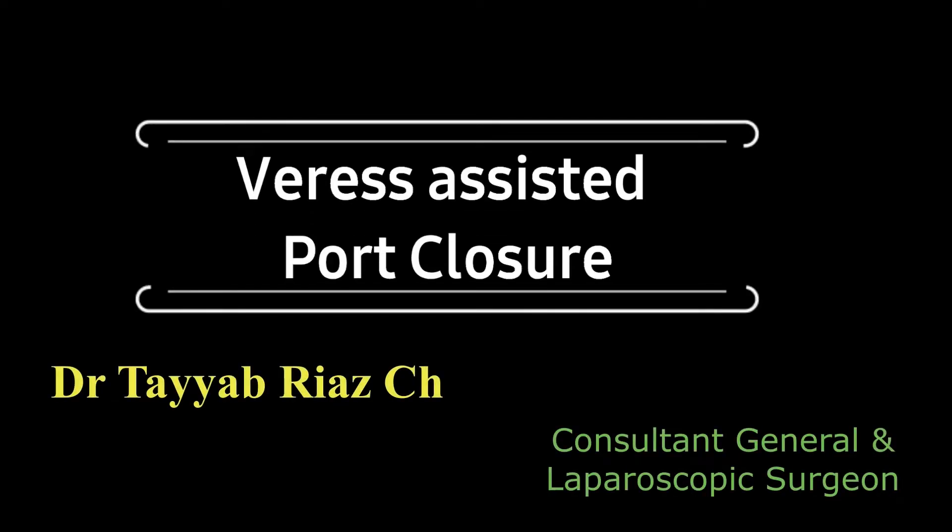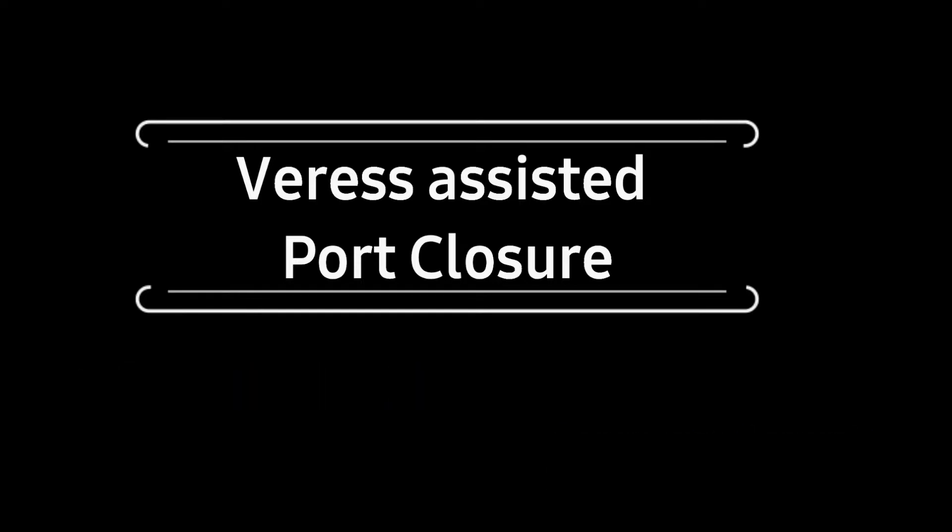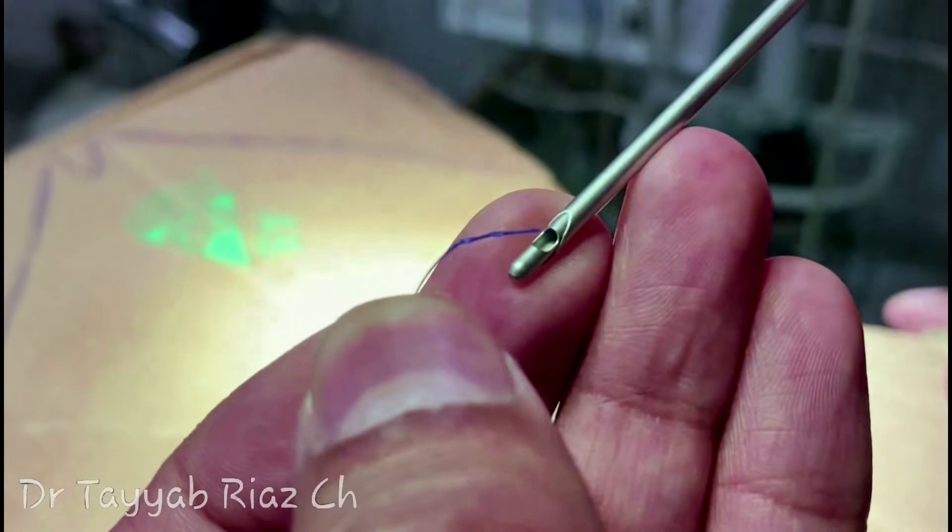There are many instruments available in the market for closure of port site defects, but today I will tell you how you can do it with this Veress needle that is already available in your tools, as you are seeing in this video.